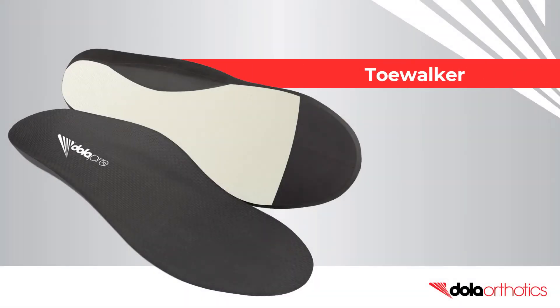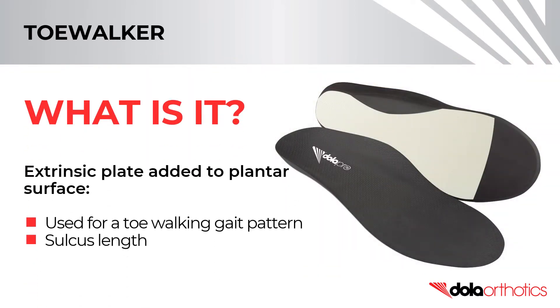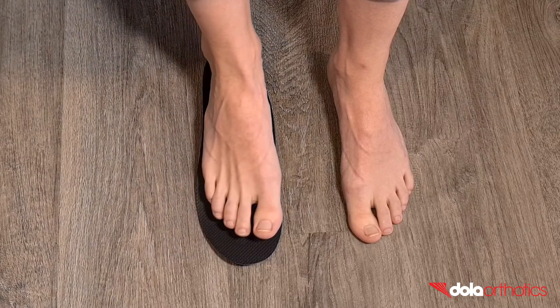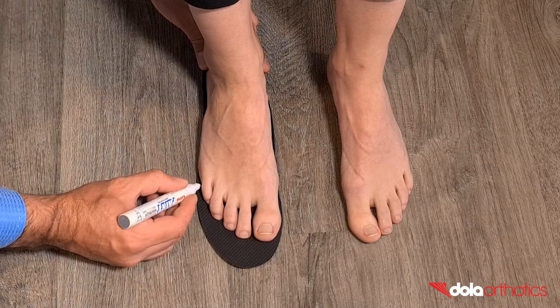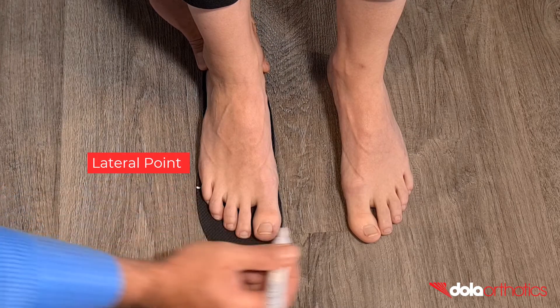A toe walker extension can be used to address a toe walking gait pattern and is commonly extended to sulcus length. In this video we will show you how to complete a toe walker extension on a full length DollarPro orthotic. The addition requires two landmarks connected by a curve to indicate the length and shape of the extension.